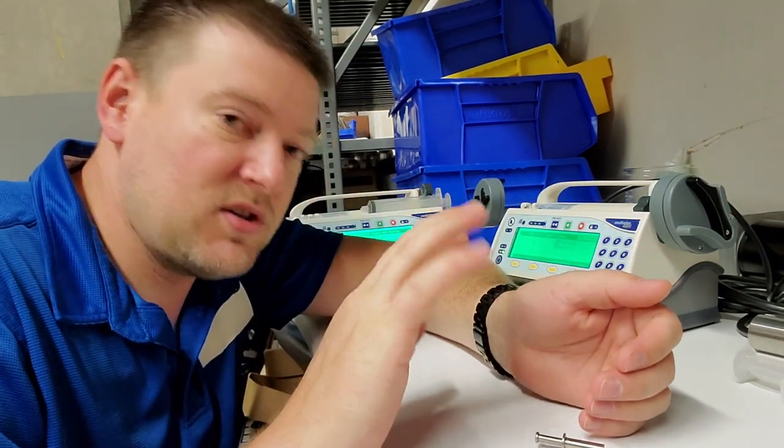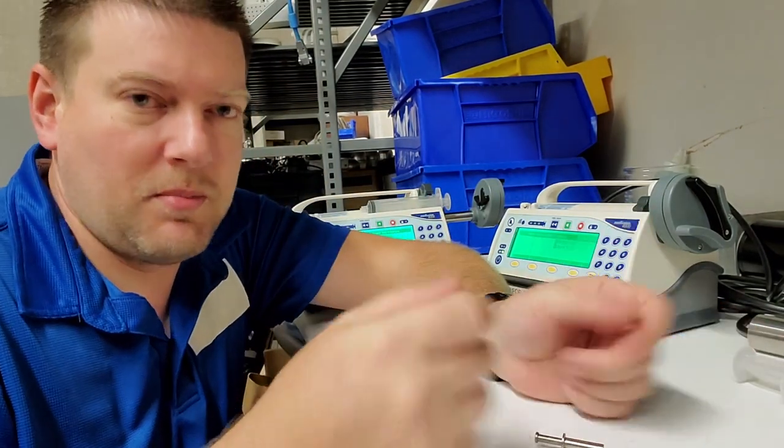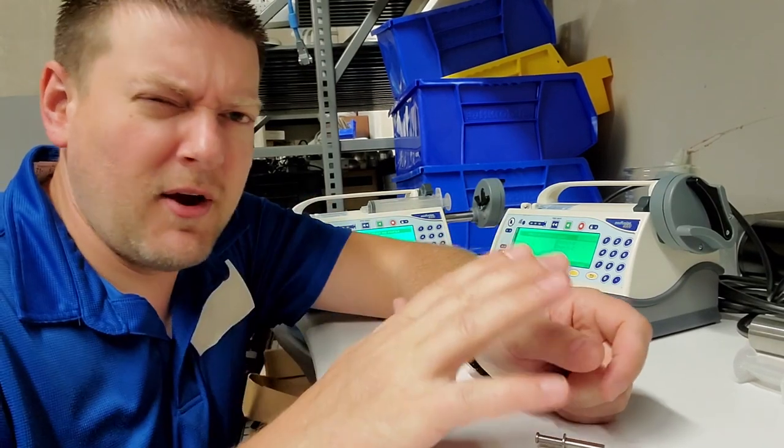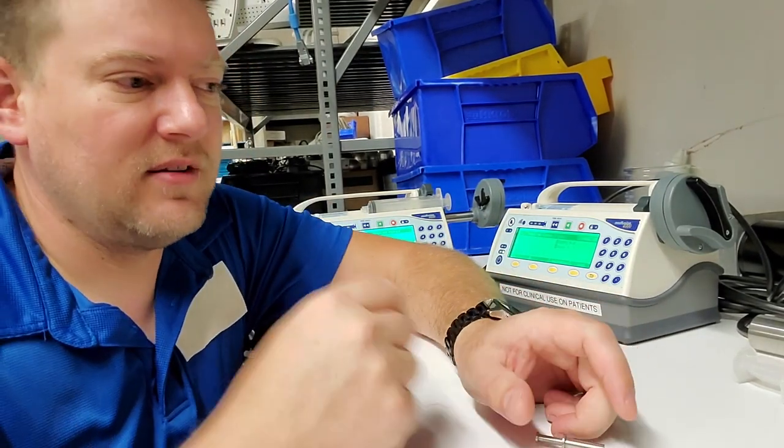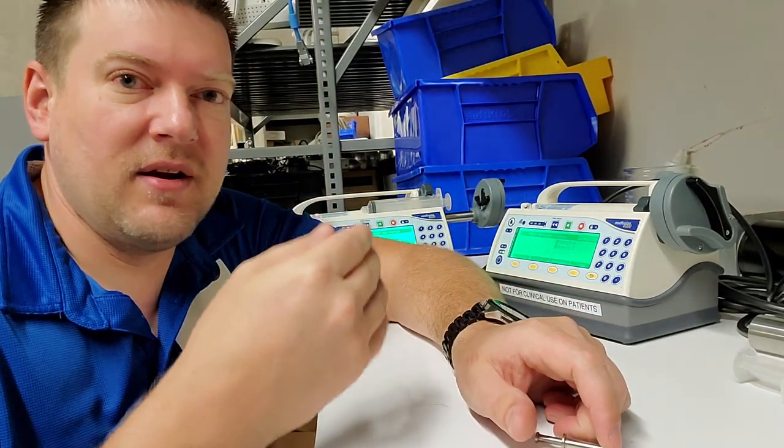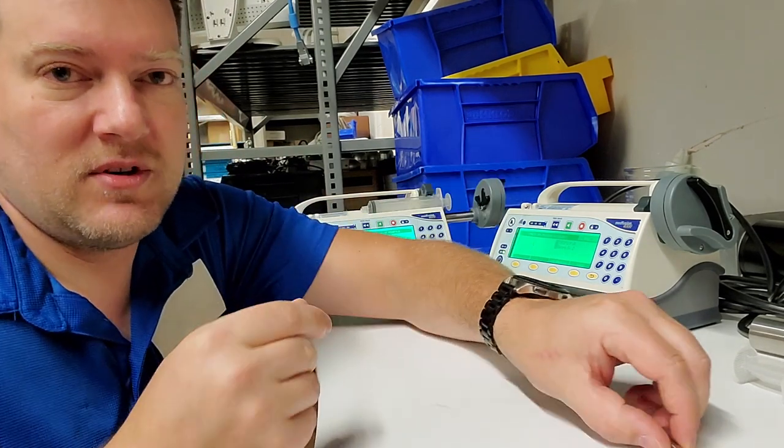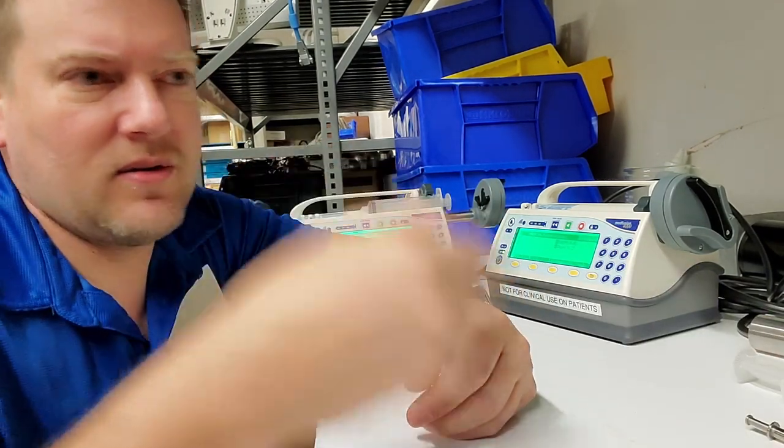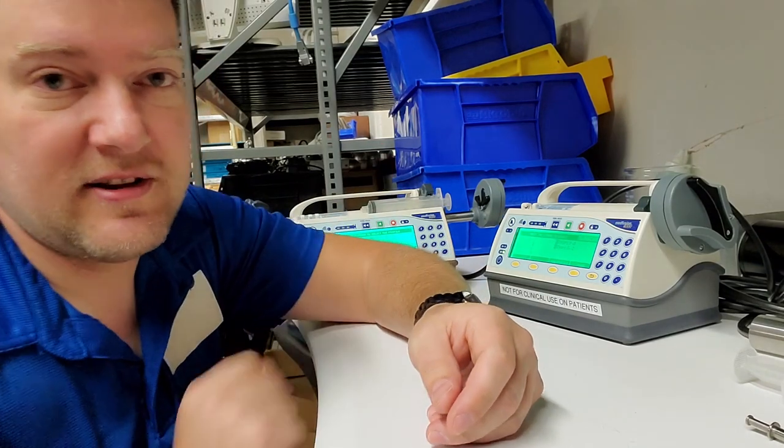The bolus is the initial surge of drug - basically a preload of drug into the system. From there it gives you maintenance drips, which is a continued set value, whatever you set the value at.